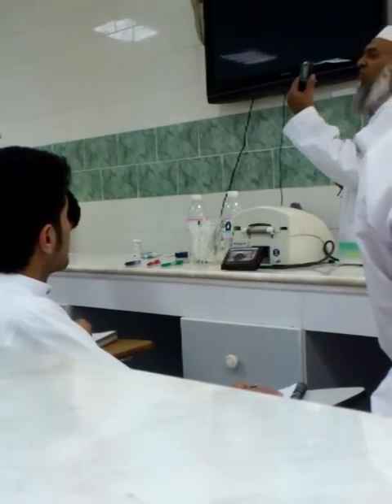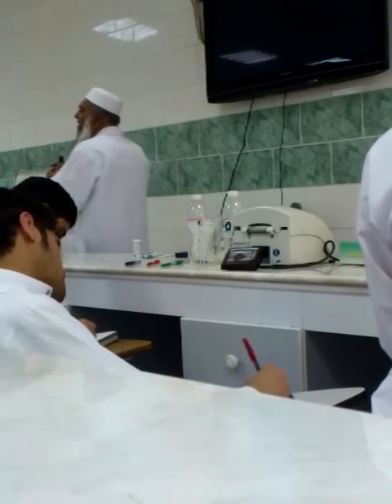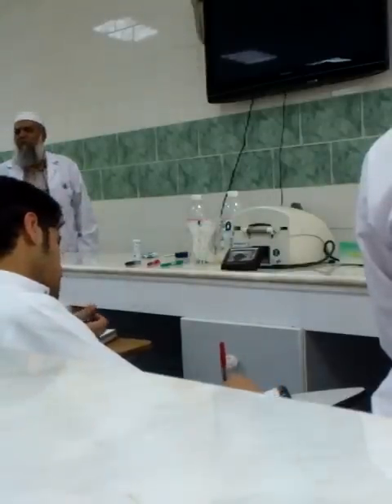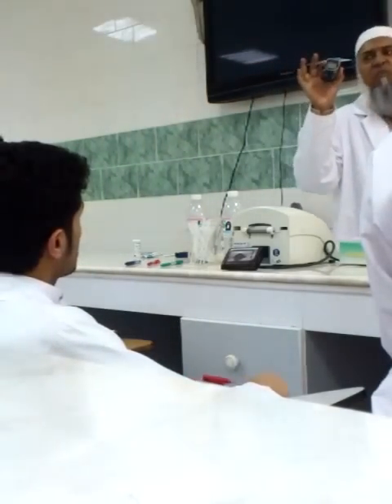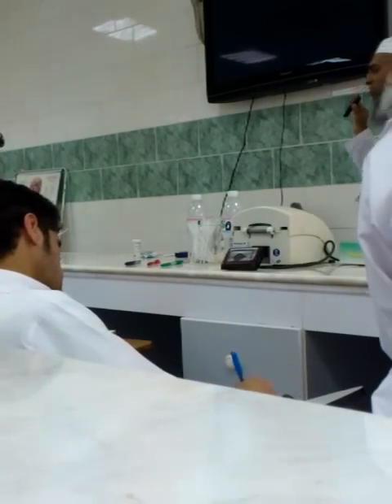But now with the availability of this glucometer, it becomes very simple for them. They just check their glucose by themselves and take their insulin. So this is a very safe, very convenient, very simple, very easy method.